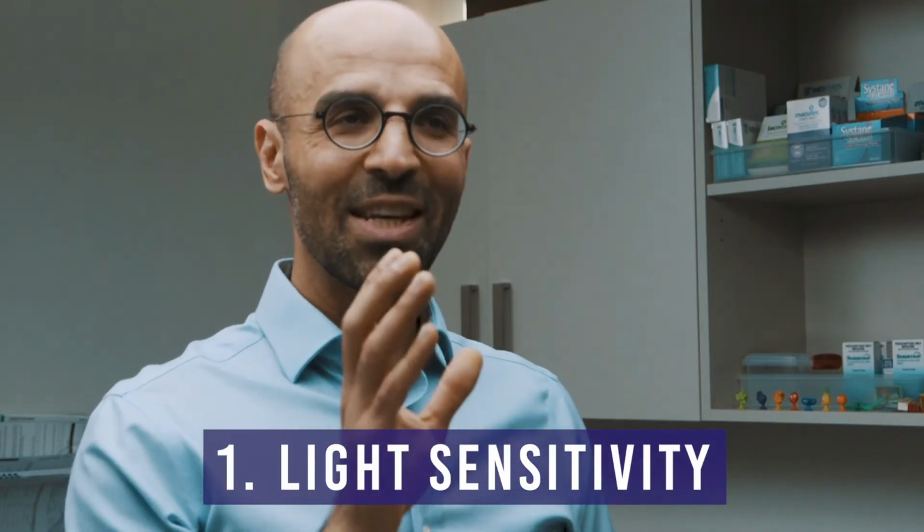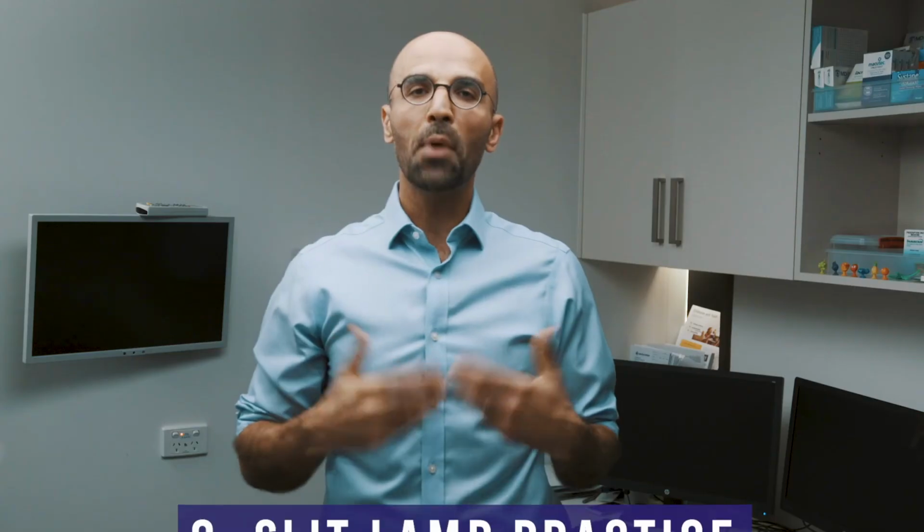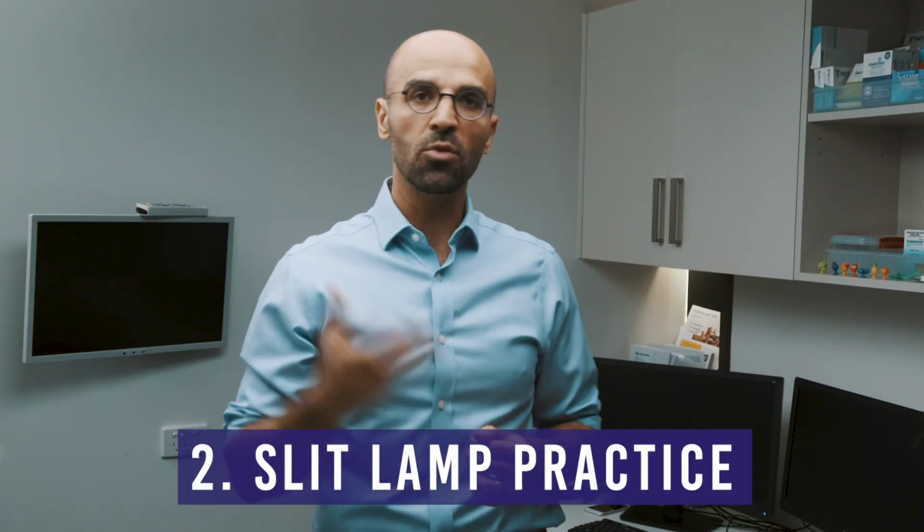Firstly, a common problem is patients being light sensitive. So to counter this, turn the room lights down, then reduce the light intensity of the slit lamp using the rheostat. You can also reduce the height and width of the beam and use the grey or neutral density filter on the illumination column. You can practice using the slit lamp by examining friends or colleagues.